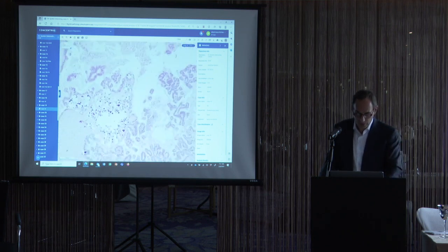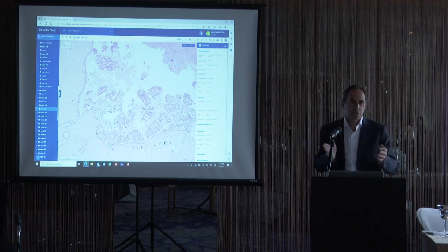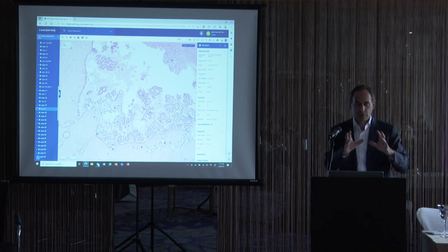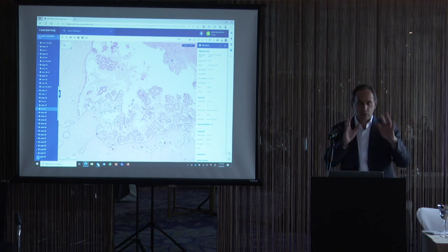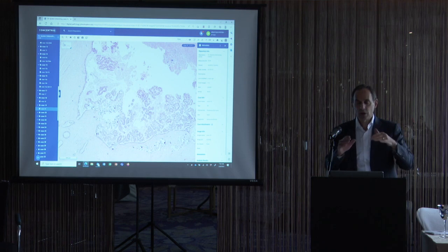In terms of terminology, I would call this a borderline serous tumor because it's analogous to what we see in the ovary. In the ovary, when you have a borderline tumor, they call it borderline because it can often spread into the peritoneum and cause a lot of local problems. It turns out in the testis and paratesticular region, when they do an orchiectomy, they cure it. It doesn't go anywhere. These lesions don't spread. So even though we call it borderline to be analogous to the ovary, this patient is 100% cured of this lesion.